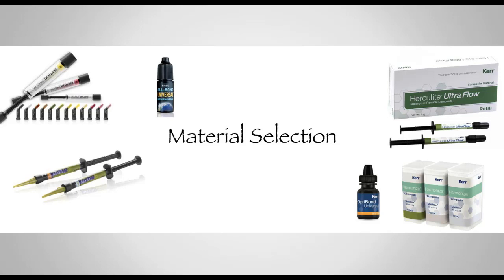If I need mandibular teeth that need some type of light occlusion, I will restore using exactly the same technique. I'll show you one case that I worked on with one of our students at the dental school. I use exactly the same technique to fabricate permanent restorations using composite on worn down incisor teeth. But definitely my number one choice for the actual prototype is going to be a flowable composite.